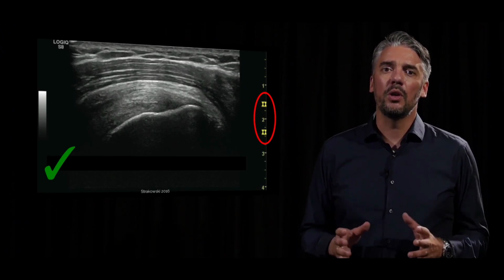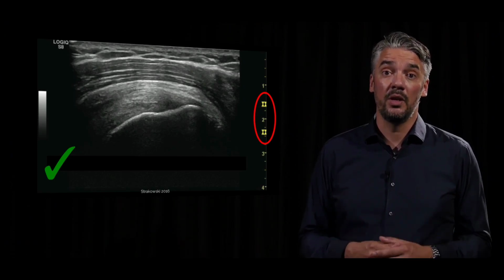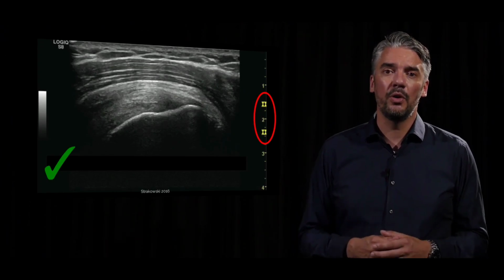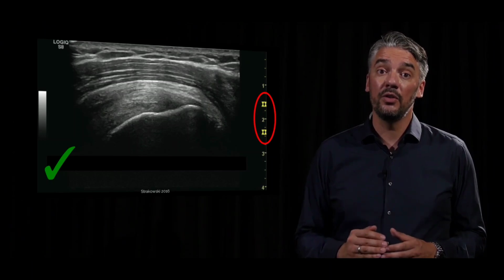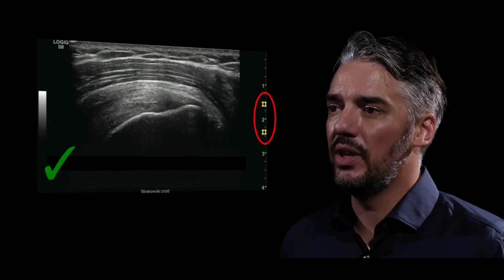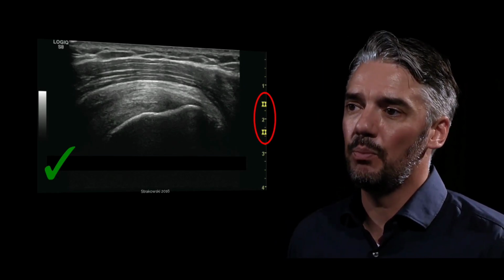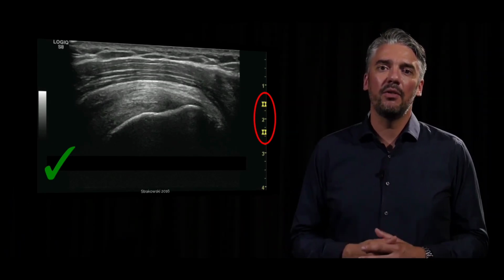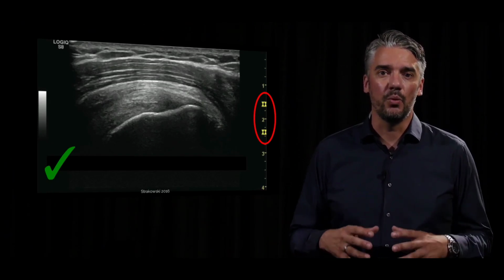However, the focal point will correspond approximately to the deepest part of the Fresnel zone, and as such, any part of the image deep to the focal point will lie within the Fraunhofer zone with associated beam divergence and poor resolution. Consequently, much better results will be achieved by placing the focal point roughly level with the deepest part of the structure to be examined. Everything above this level on screen will be within the Fresnel zone and will therefore lie within the region of relatively high resolution.